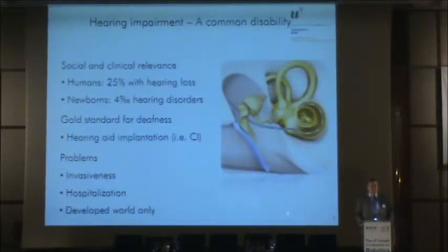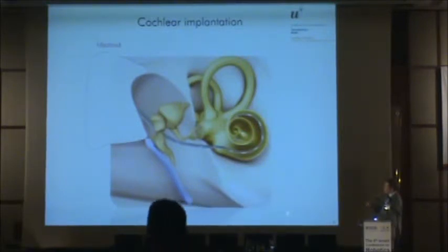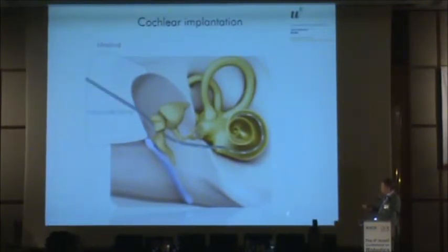And the question is, how do you put that implant in, under which level of invasiveness, and of course how long does the patient have to stay in the hospital. We look here a little bit bigger into the picture. What we see here, the first part between the middle ear and the outer side of the patient is the bone. It's called the mastoid temporal bone. It's the hard bone behind your ear. You can feel it with your fingers. One has to go through this by drilling a hole effectively, putting the electrode through here.